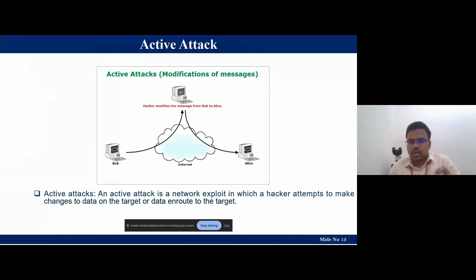When it comes to IoT based medical devices, all these devices are interconnected, and through the gateway, all these devices are connected with the cloud. So if one device is breached or attacked, it's easy for the attacker to enter into the system. They can spread around the network and they can destroy the entire system. So this is the main idea. We need to understand each and every aspect of this cybersecurity concept.